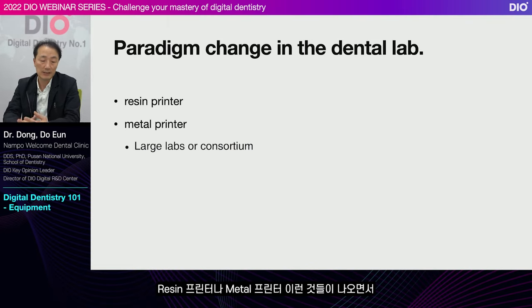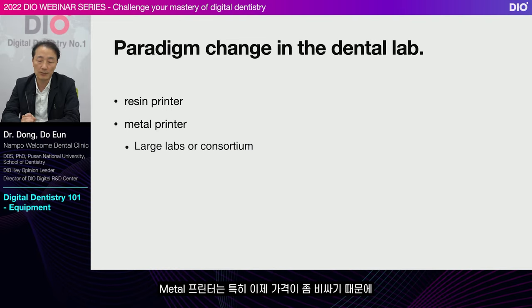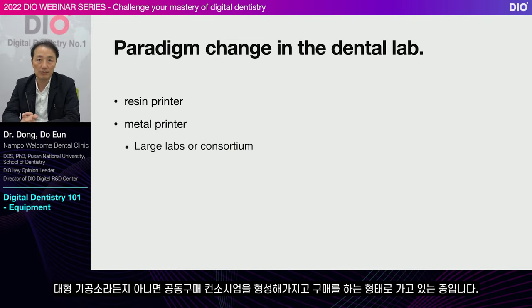As resin printers and metal printers have been introduced, dental laboratories are gradually changing from analog to digital. Metal printers, in particular, are a bit expensive, so they are mainly used by large labs or in joint purchase consortiums.